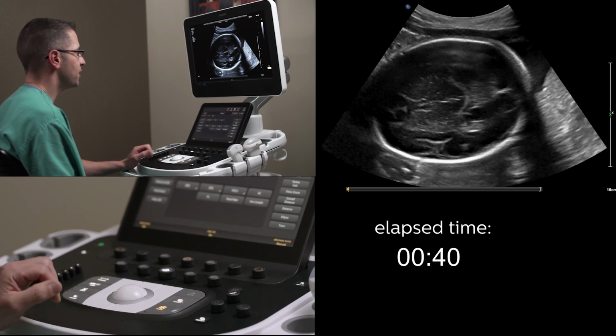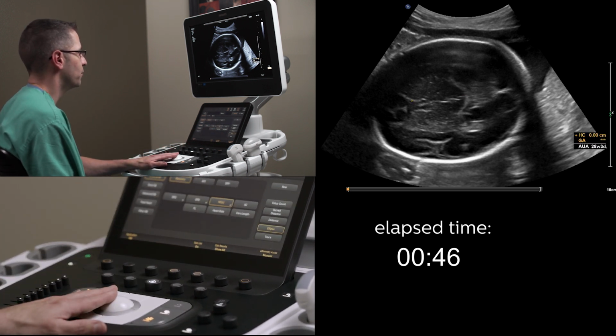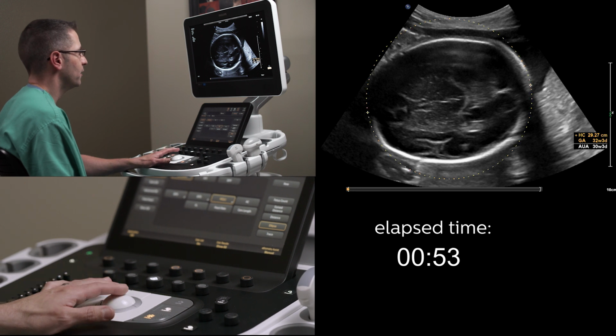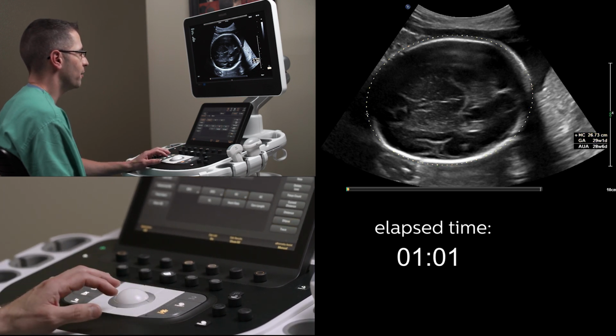We're going to then erase these, and I'm going to deploy and measure the head circumference. So we're going to click head circumference, and what you're going to see is I again have to use my left hand a bit, maneuver over to the back of the head, alternate the ellipse and select and maneuver the ellipse to make sure I'm happy with that, and then actually acquire that measurement.